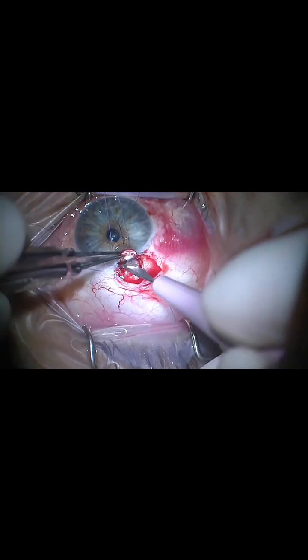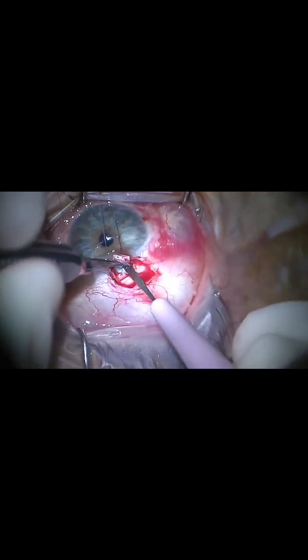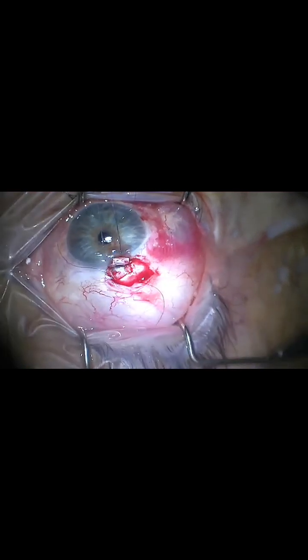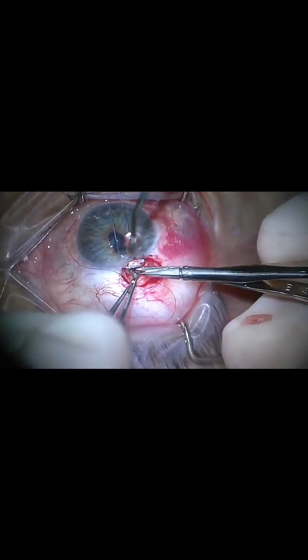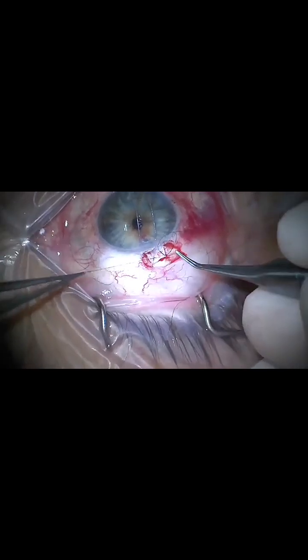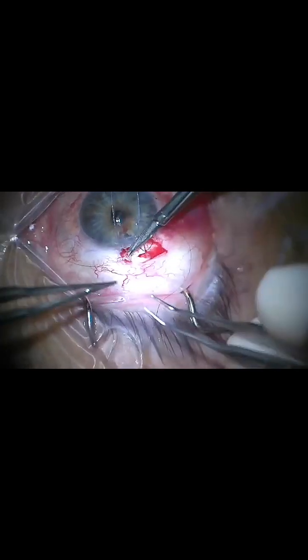Entry into the anterior chamber is made at the far anterior extent of the flap using a 30-degree blade, and that same blade is used to excise a block of scleral tissue to create the ostium for the flap. Toothed forceps and Vannas scissors are used to perform an iridectomy. The pre-placed sutures are tied using slip knots to allow for adjustment of tension and titration of flow. The knots will then be rotated and buried.